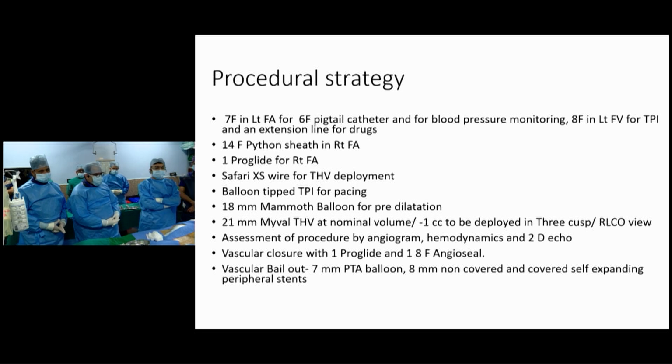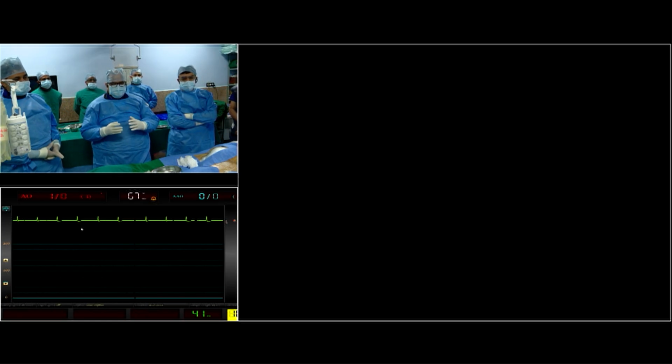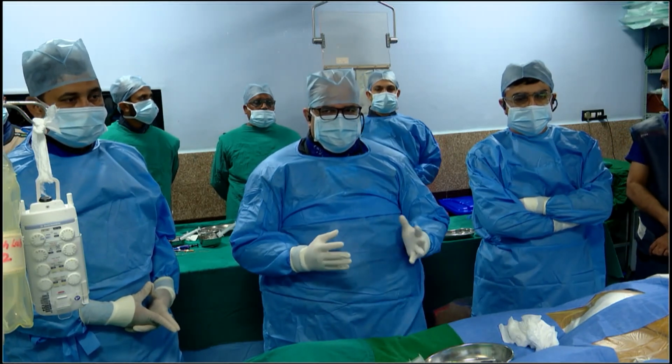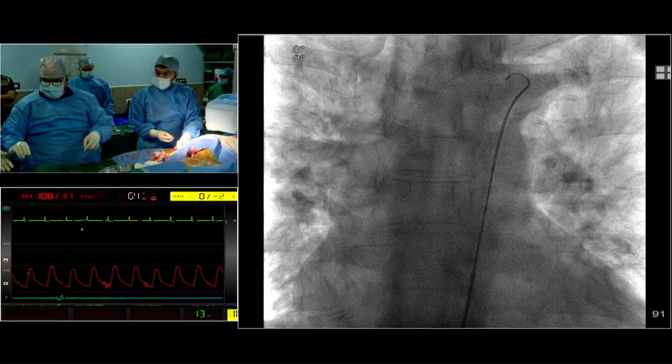Thank you. Yeah, that's correct. The only thing is it's a 21.5 Myval. We are taking something minus, so we are anticipating the diameters to be 21. Let's take a 12 French, which is already there on the table. Just put a 12 French.